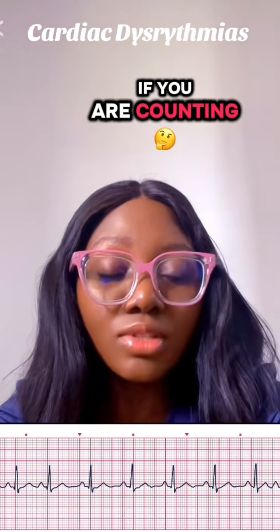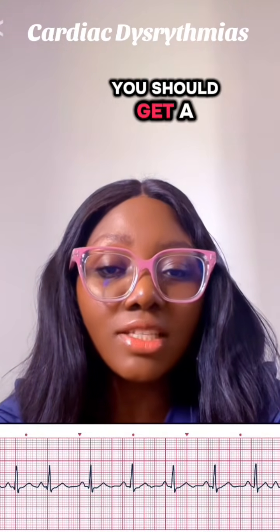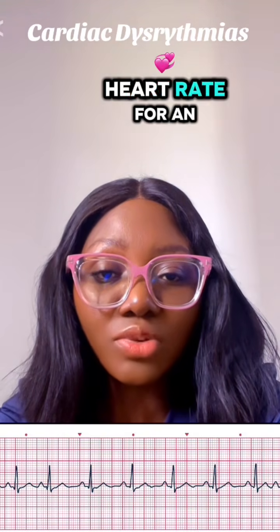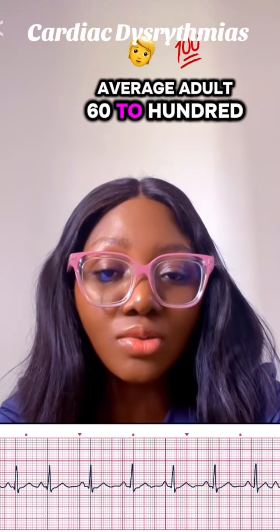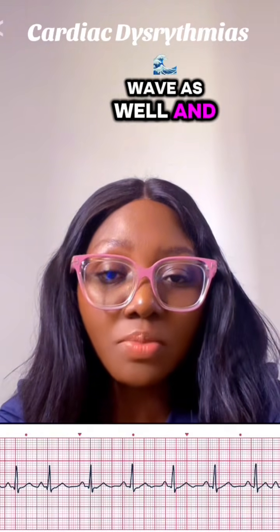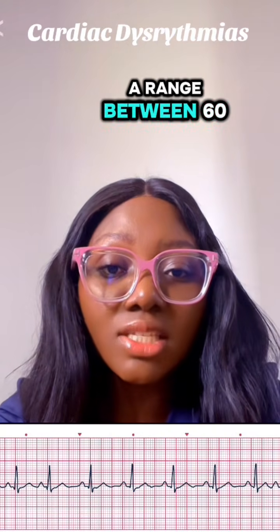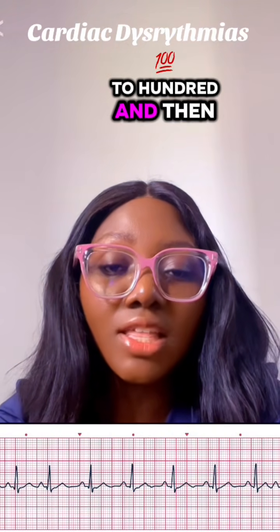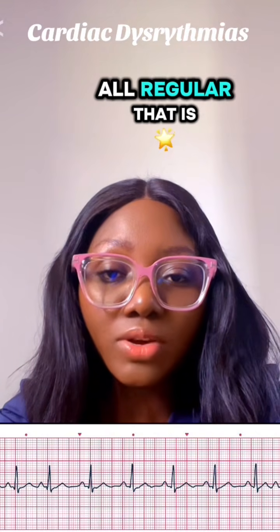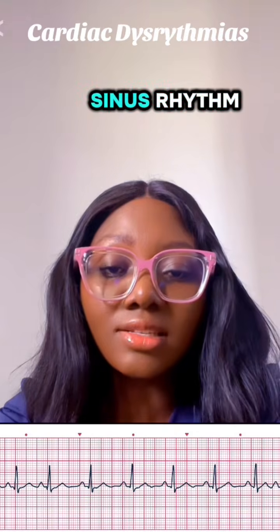If you are counting your RR intervals and multiplying by 10, you should get a rate between 60 to 100. That is the normal heart rate for an average adult, 60 to 100. And then if you are counting your P wave as well and multiplying by 10, you should also get a range between 60 to 100. And then the RR intervals and the P waves are all regular. That is how you can know that this is a sinus rhythm.